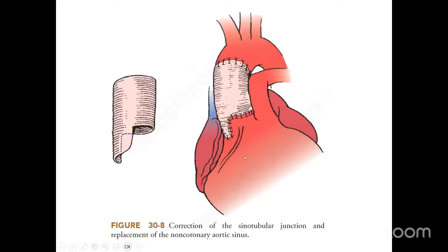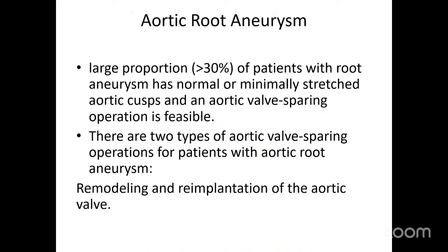Here is the new aortic sinus, with the sinus excised and created with the Dacron for the non-coronary aortic sinus.